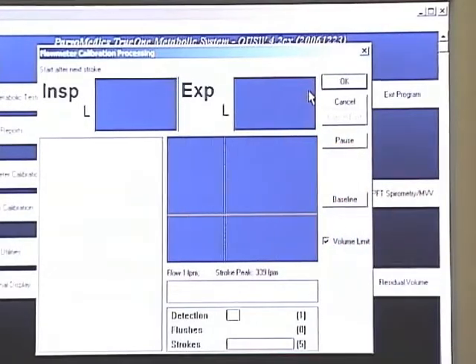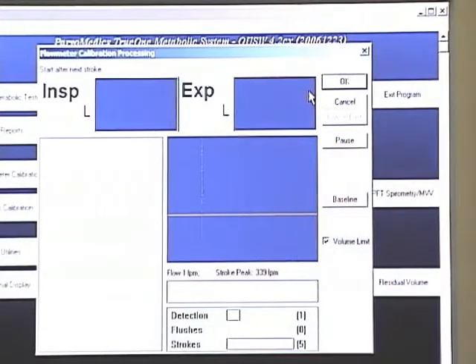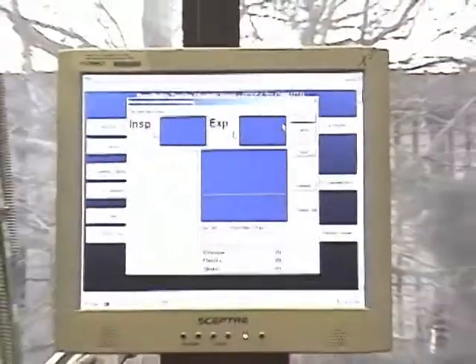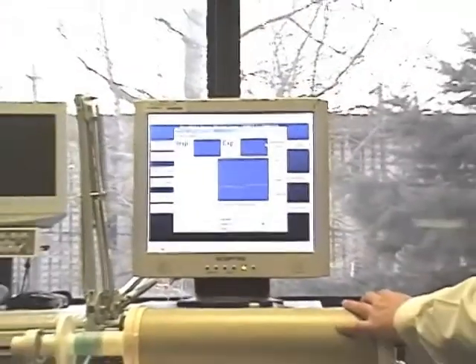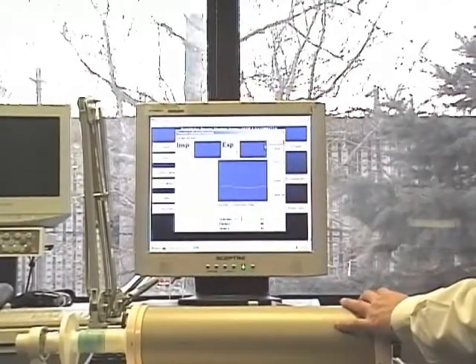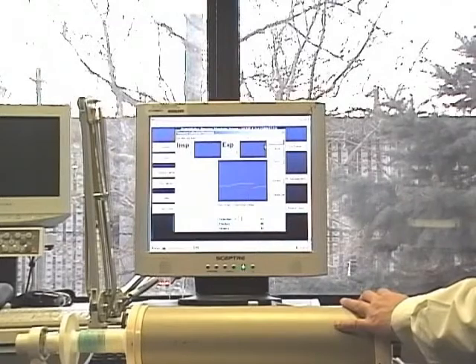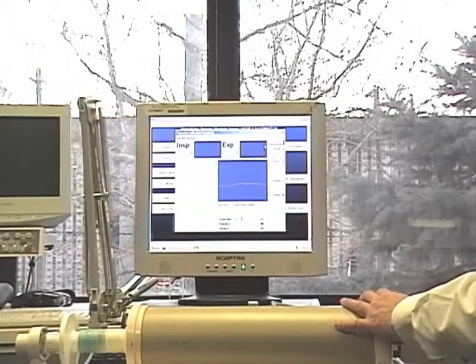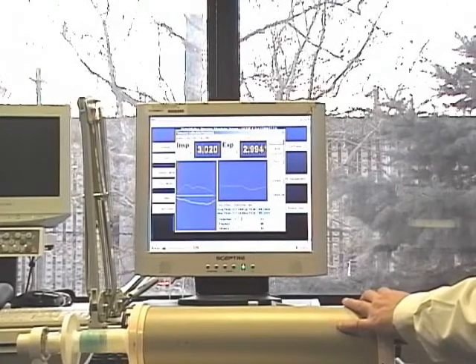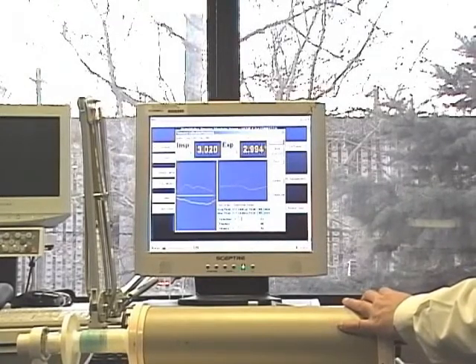That was the start inspiratory, and I will have an expiratory a little bit more in expiratory.